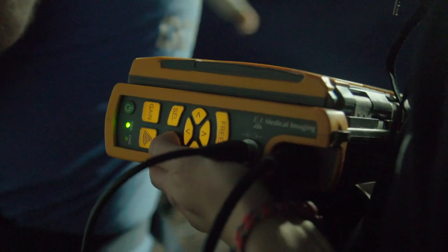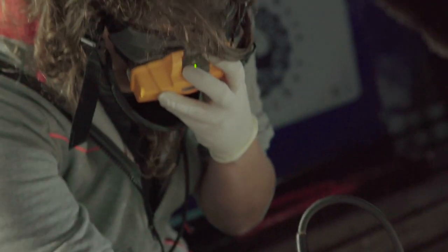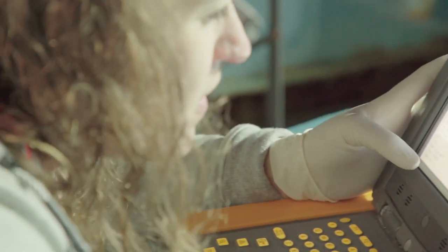Traditionally, when looking at reproductive studies, the capture of animals would end up with them being sacrificed and dissected. But through an ultrasound, we can use a non-intrusive, less invasive means of looking at these organs and being able to assess the reproductive stage and maturity of these animals.